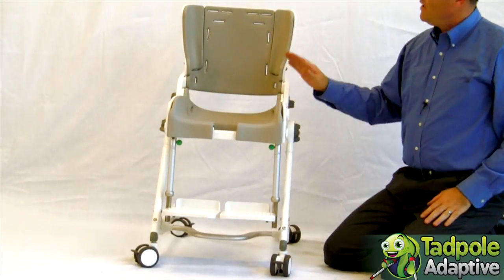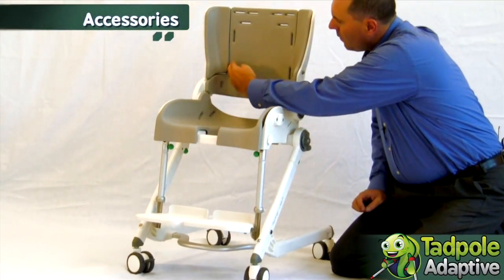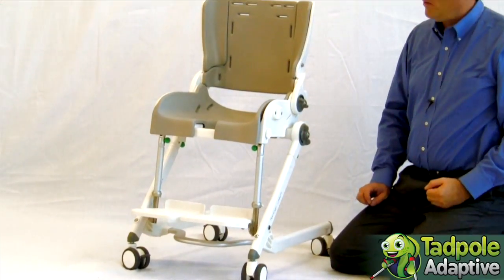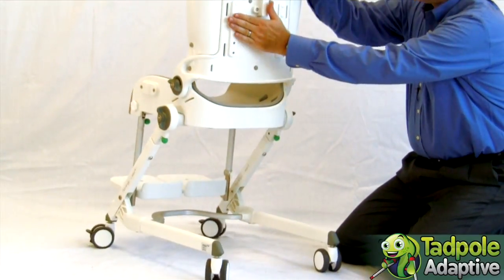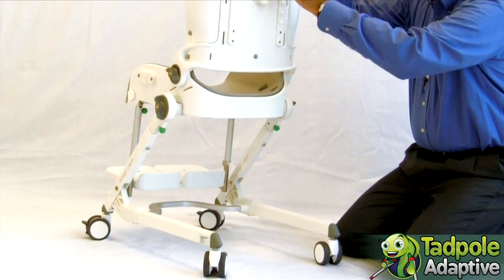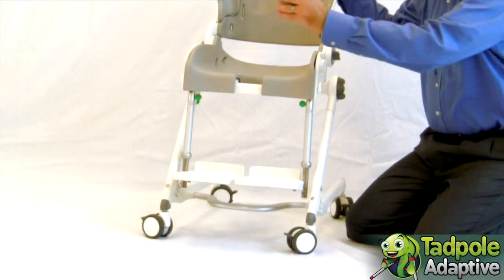The Flamingo has a variety of accessories, including cuts for straps and harnesses as well as positional pieces for lateral supports, headrests, and other positional devices as needed for the body.